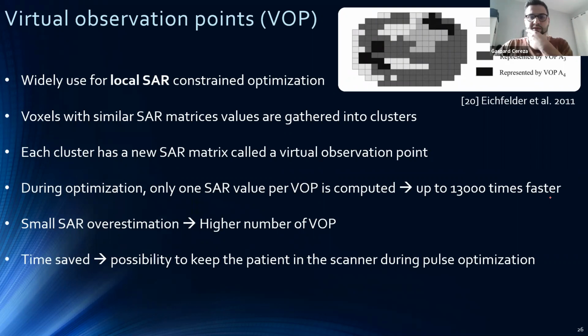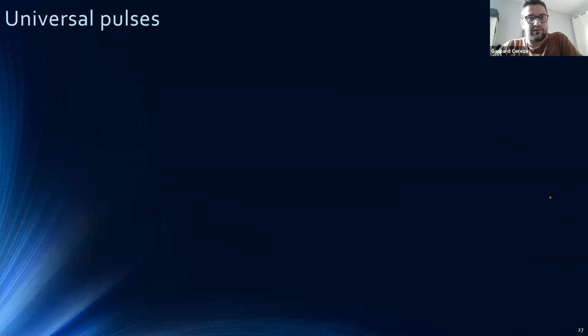So with the time saved using the VOP, it's the only thing that allows us to keep the patient in the scanner when we are optimizing the pulse for full transmit parallel imaging, parallel transmit. So that's a very interesting point.